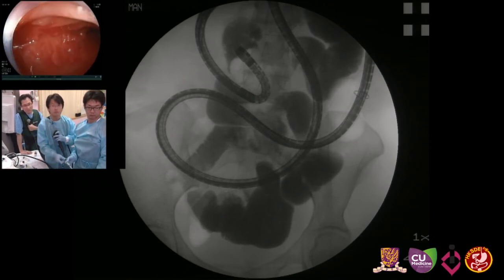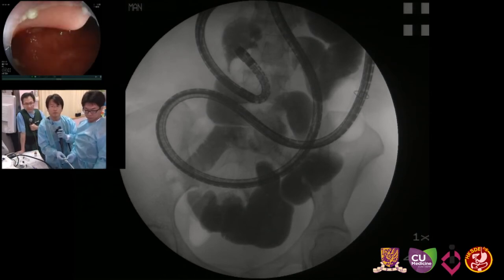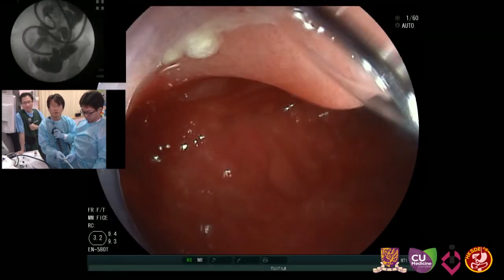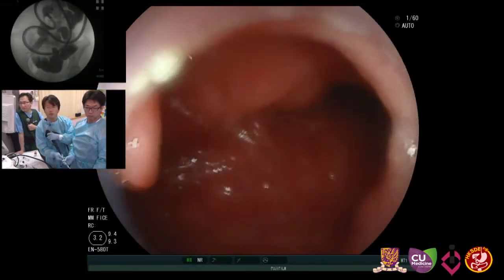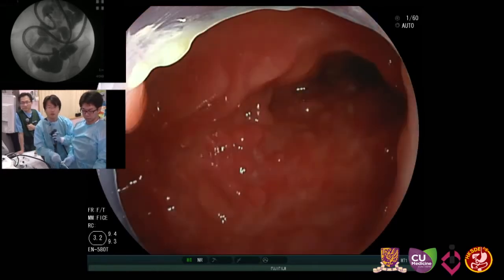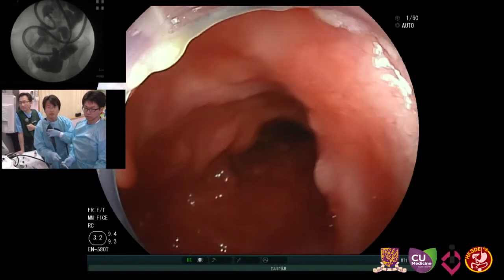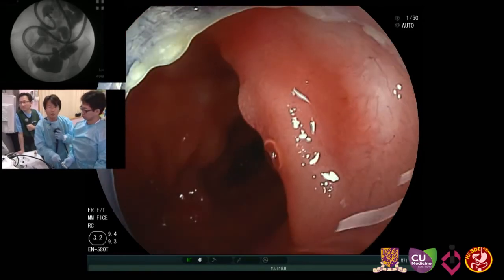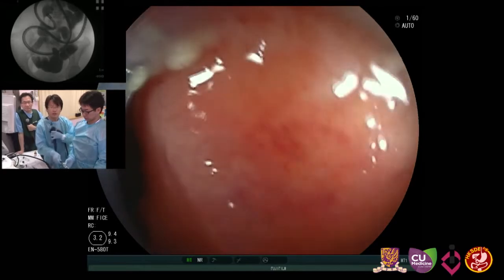So when you see these polyps, do you need to take a biopsy, or do you have anything to further enhance the examination of this polyp or inflammation? Just inflammatory polyp, so I don't think we need to take a biopsy. I see. It's not suggestive of any neoplastic changes. I see. So I will come back to examine the intestine.